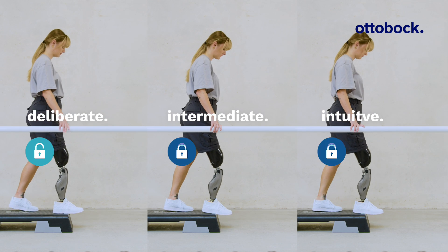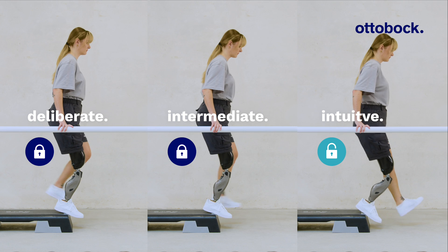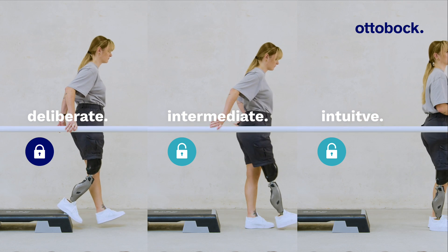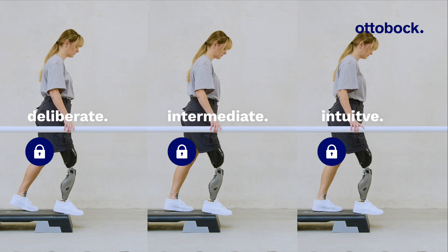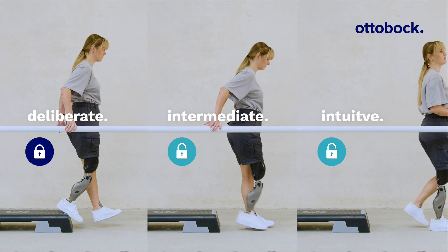Here we see a comparison between a deliberate, an intermediate, and an intuitive setting. Notably, with the deliberate setting, it is not possible to step down a stair out of the stance function.